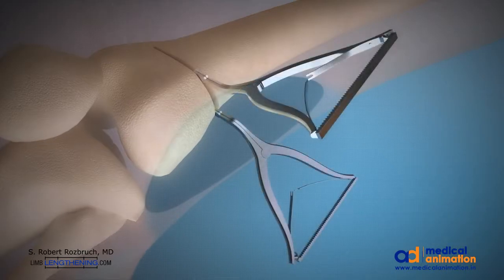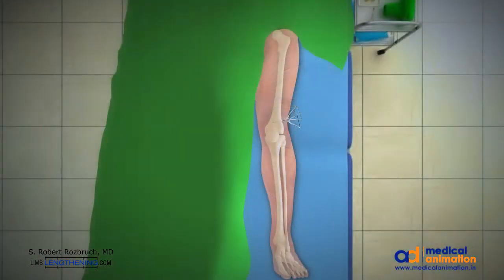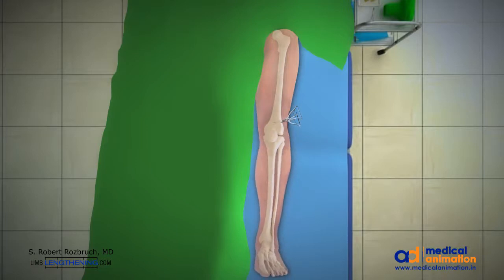Laminar spreaders are then used to distract and open the osteotomy on the lateral side based on the preoperative templating. The open wedge corrects the valgus deformity and this is checked in the operating room with a hip-to-ankle line.